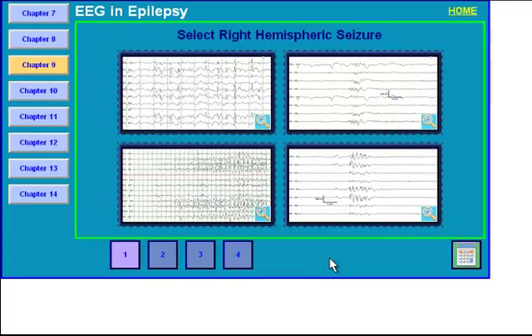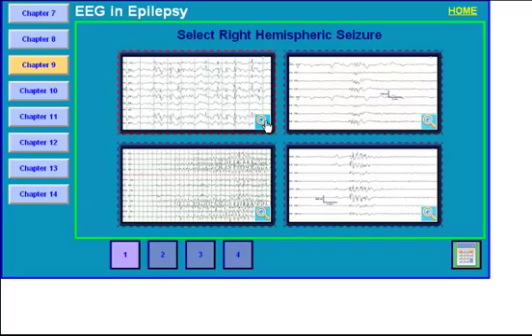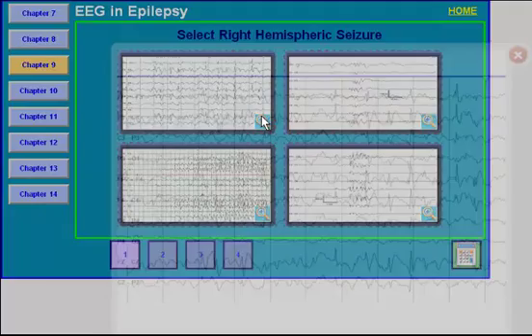Hello, welcome back to the EEG Reading Rounds. I'll start with Chapter 9 today. So the first question, select right hemispheric seizure. Let's enlarge each of these images and then we'll discuss the different characteristics and EEG findings and then pick up the right answer.